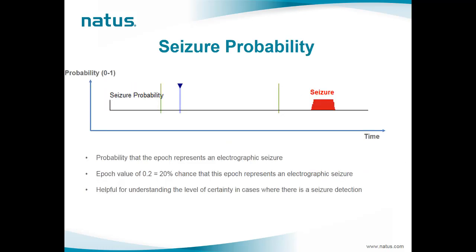Persyst trending includes both seizure detection and seizure probability trends, which are closely related and represent stages in the output of the Persyst seizure detector algorithm. The seizure probability represents the probability that an epoch represents an electrographic seizure — for instance, a value of 0.2 means there is a 20% chance that epoch represents an electrographic seizure. The seizure probability trend provides a second-by-second display of calculated seizure probability, in contrast with the seizure detection trend, which provides a discrete value of 0 or 1 depending on whether a seizure has been detected.